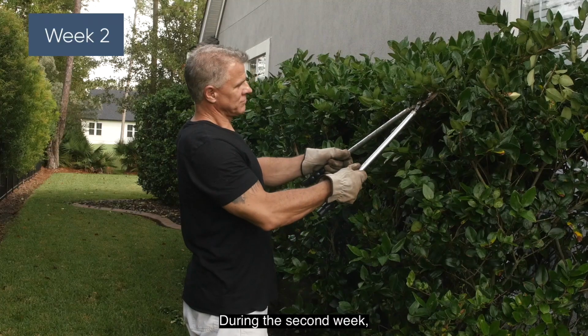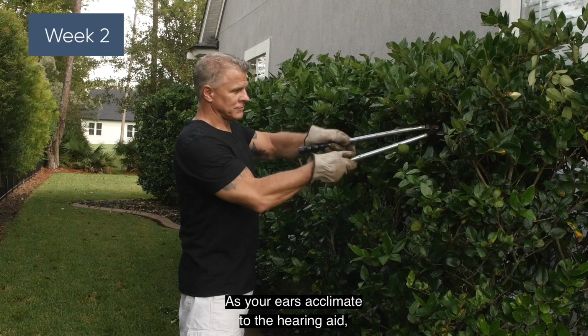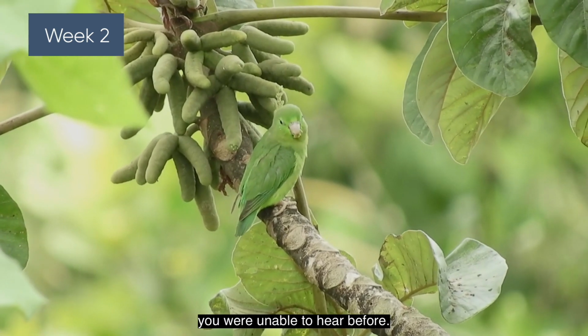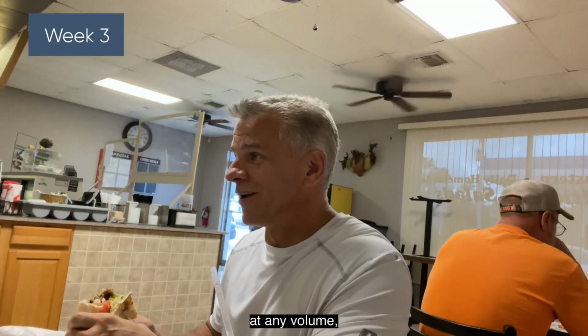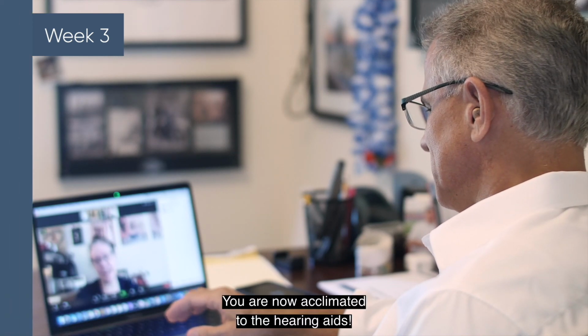During the second week, start wearing your hearing aids outdoors. As your ears acclimate to the hearing aid, extend the use to 3 to 4 hours per day. At this point, you'll start to notice little sounds you weren't able to hear before. By the end of the third week, you can start having regular outdoor conversations at any volume, whether you're at a crowded restaurant or at work. You're now acclimated to the hearing aids.